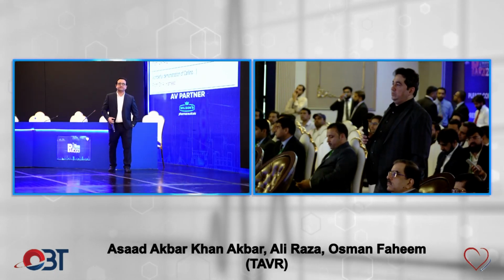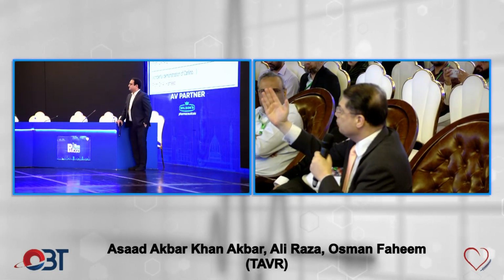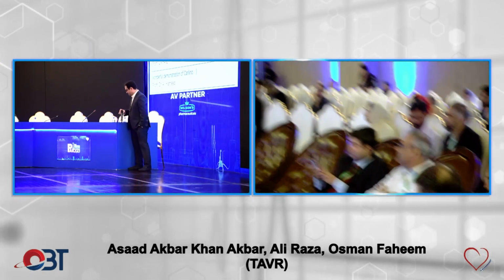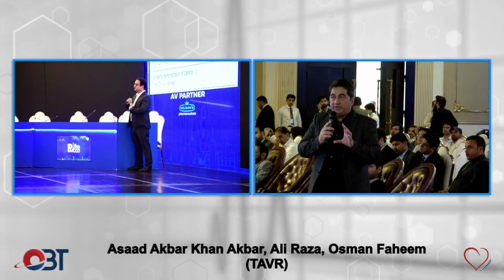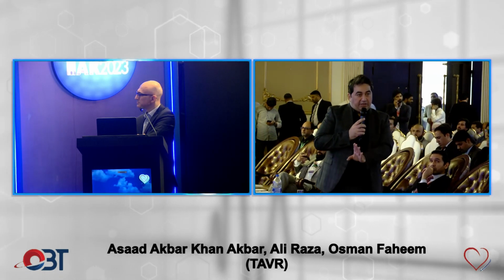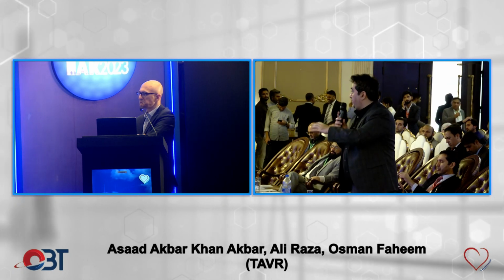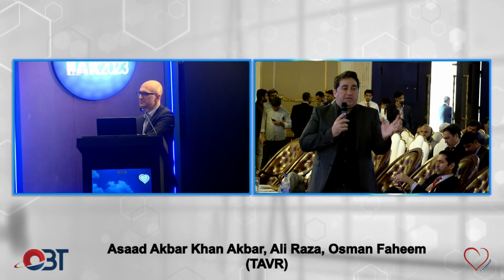Do we measure the leaflet size in order to determine कि वो leaflet मतलब कितना है, उसको space चाहिए या नहीं? That is not important. People do. Go ahead. People do that. I think we are thinking about the leaflet height too much at the moment. I think leaflet height is just a rough measure with the rest of the things. Like ये आपका supportive है उसके साथ. Leaflet height पे मैं अपना decision, I wouldn't base my decision on the leaflet height. Whatever leaflet height is, like Asad mentioned, it will fall down, sinus is big enough.